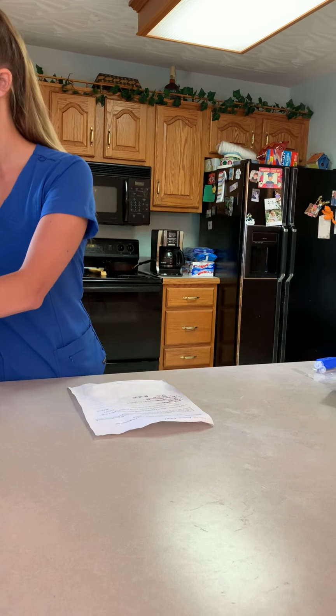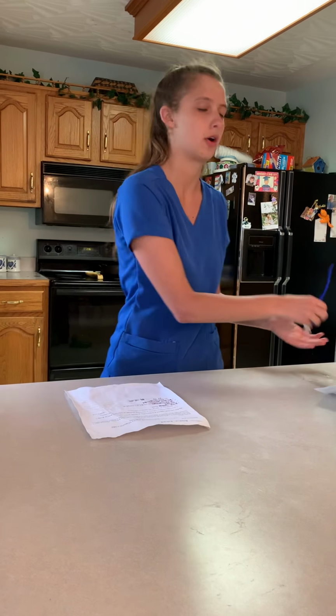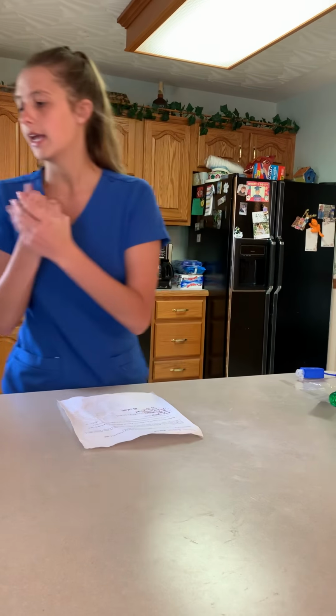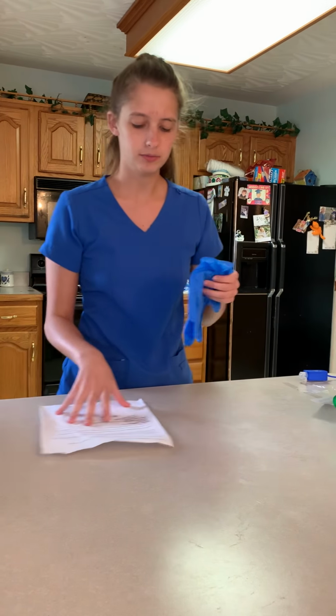Next, I'm going to raise the bed up to an appropriate height, and I will lower the side rail closest to me. Now I'm going to get my supplies in line. Okay, I'm just going to wash my hands first, and I'm going to gather 2 clean gloves.